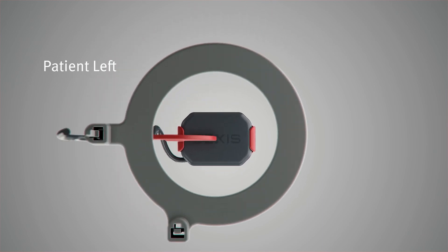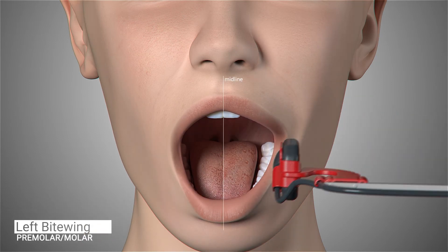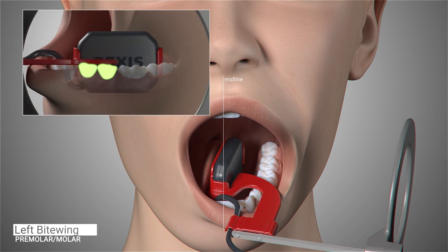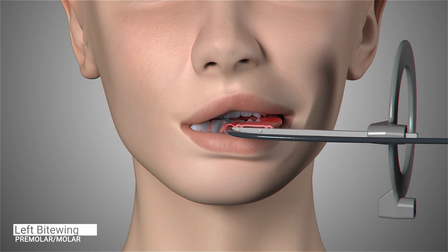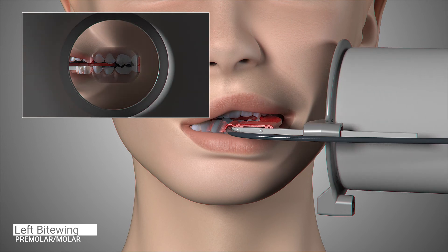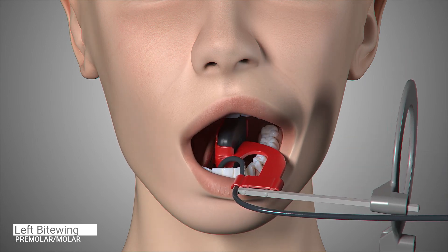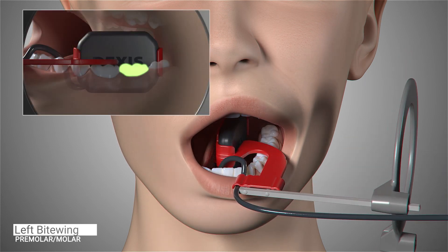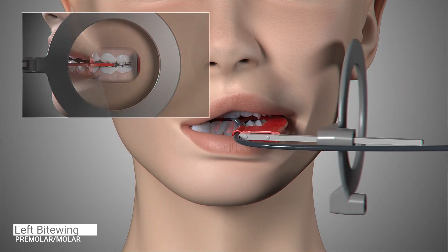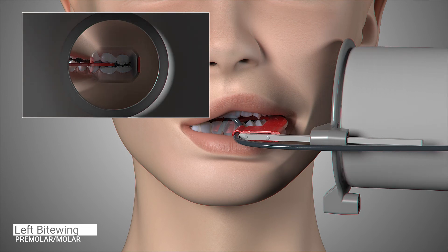The configuration of the sensor and holder does not change for the next and final set of images: the left bite wings. Ask the patient to open slightly and center the first and second premolar on the sensor to capture the distal of the canine. Ask the patient to close, slide the aiming ring close to the patient's face, position the x-ray emitter cone flush with the aiming ring and trigger the exposure. Position the sensor so it is parallel to the occlusal line, center the sensor on the second molar and ask the patient to close. Slide the aiming ring close to the patient's face, position the x-ray emitter cone flush with the aiming ring, and trigger the exposure.